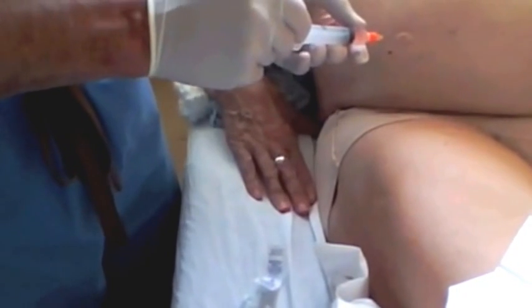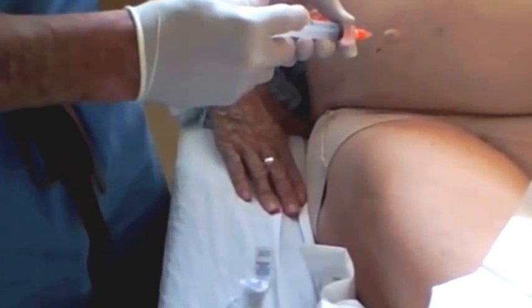Once the area is prepped, you have to raise a little wheal with some lidocaine. Just a small area needs to be anesthetized — these are small catheters we're using. And then you put some deep lidocaine in as well.